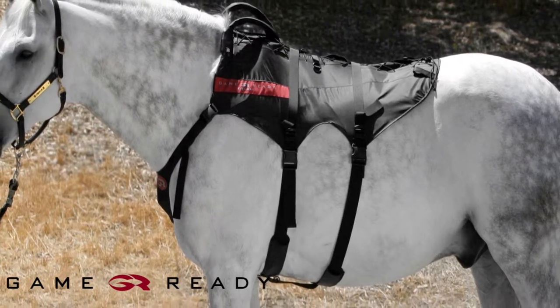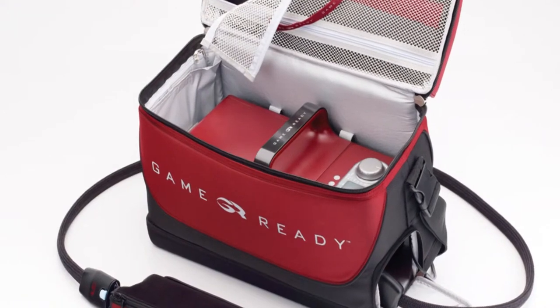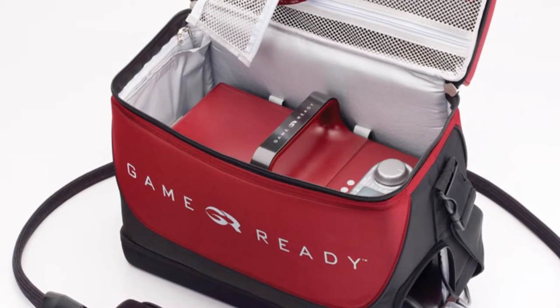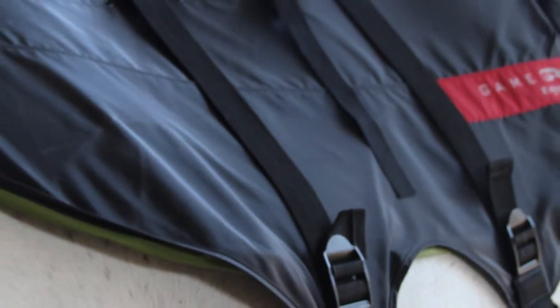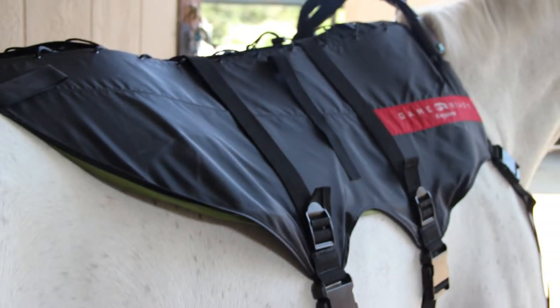Welcome to the GameReady Equine Backwrap application video. GameReady uses Axel technology to apply cold and active pneumatic compression therapy designed to help your horse recover from injury or surgery as quickly as possible. This video will demonstrate how to apply the Equine Backwrap.